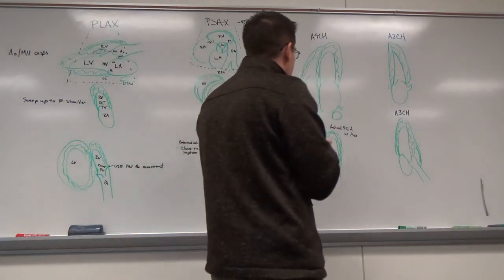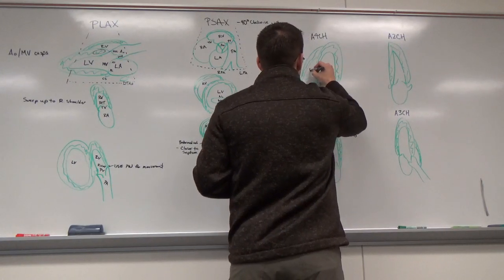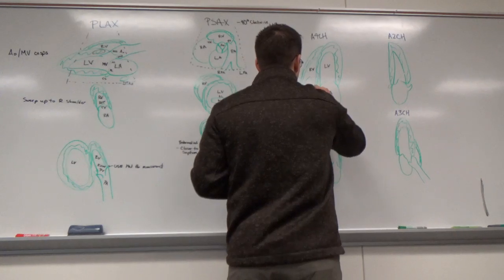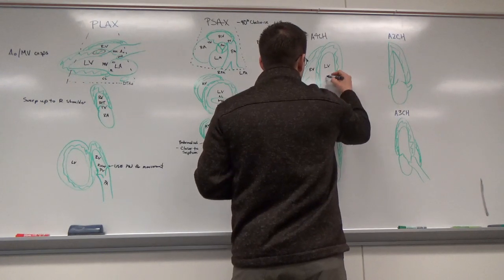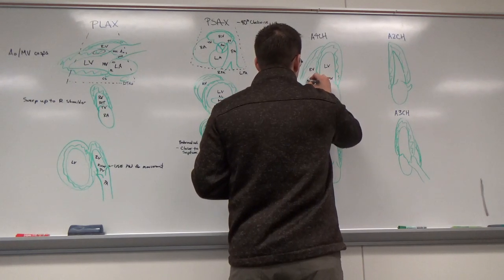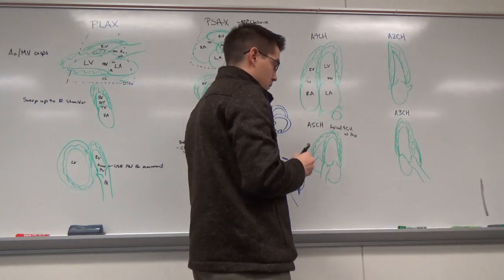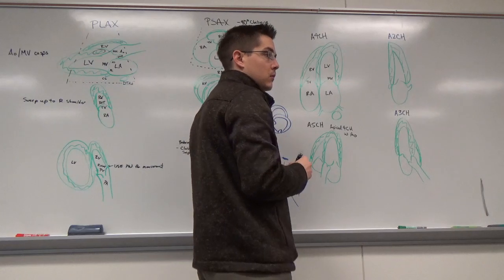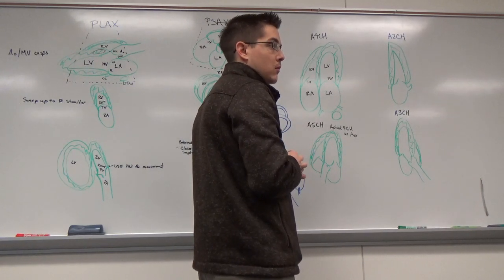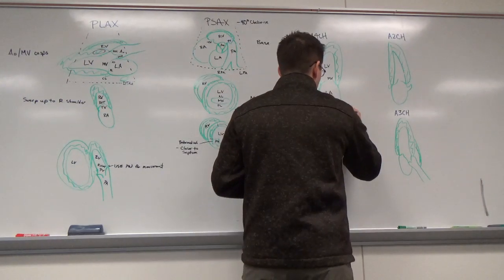All right, 4-chamber view. What chambers have we got? Left ventricle. So LV, RV, that is correct. Always make sure they're oriented correctly. Once you get these down somewhat, and then you get onto a system like the Toshiba where you have to intentionally go backwards to make it right, it seems. You're fighting yourself because you know you need to go a certain way, but it doesn't look right, and you're like, I'm trying to go that way, but it's going this way. Sometimes you just got to look at your anatomy again and be like, oh, I'm backwards.